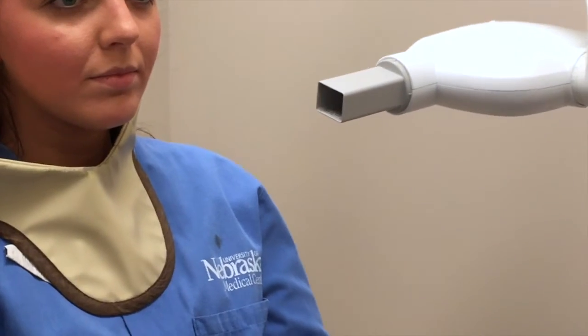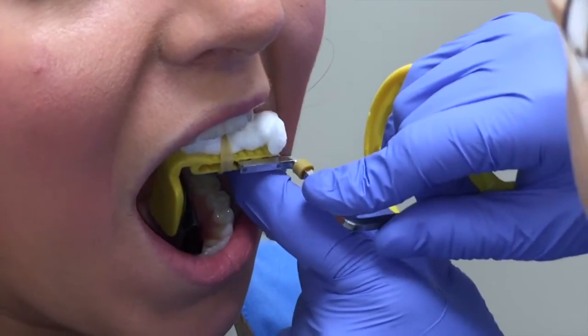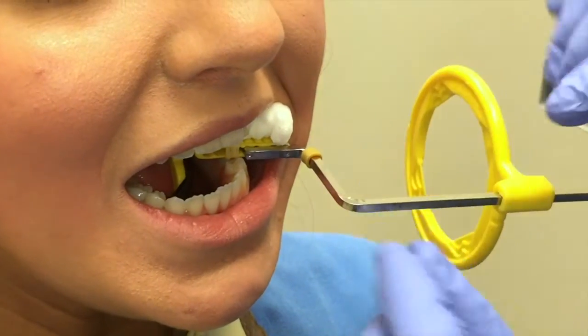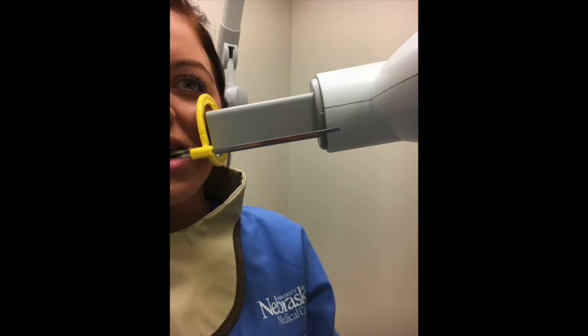The clinician will now take a premolar periapical, being sure to capture the distal half of the canine. The position indicating device must be placed centered to the ring and parallel to the handle.